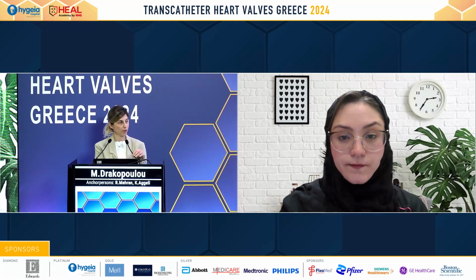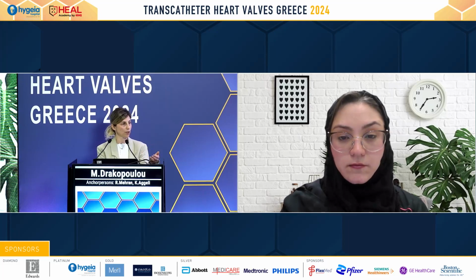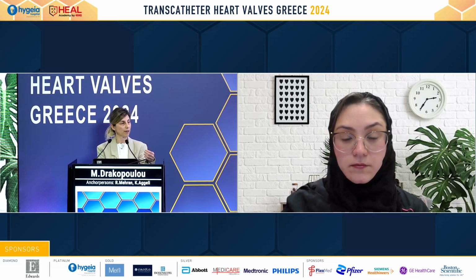I think in everyday clinical practice, we can assess the tricuspid valve very well by echo, and I will insist on assessing also the RV function, LV function, and actually understanding the pathophysiology of the tricuspid regurgitation. I don't believe that in everyday clinical practice we need more imaging. But in patients that are scheduled or are for discussion for further interventional therapy or even surgery, maybe we need something more, but this is individualized.